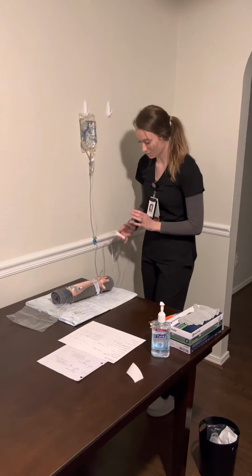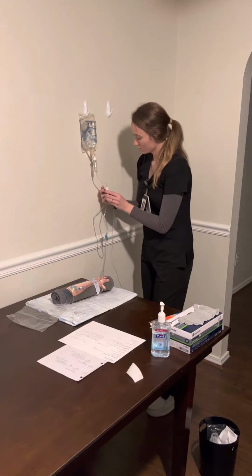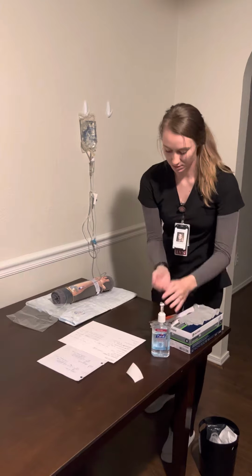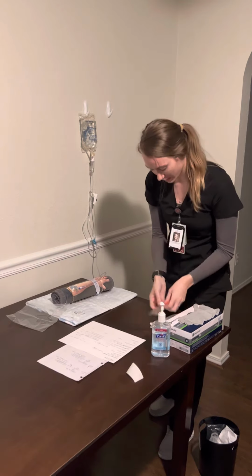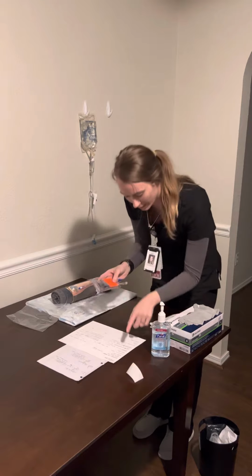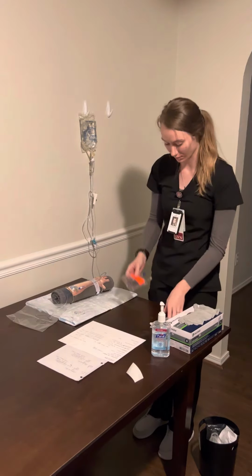I'm going to leave that where it is at that drop factor. I'm going to wash my hands and prepare the cefazolin. Alright, so for my third check, I have here cefazolin 1 gram and cefazolin 1 gram. It is in 50 milliliters. We're going to get that at 25 drops a minute.